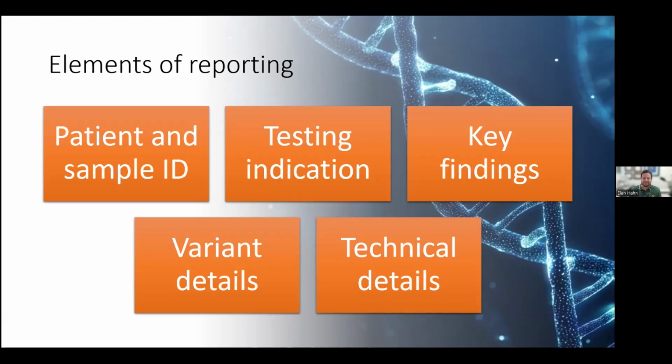So that you didn't have enough coverage of key genes in a negative test, that's a bigger issue than not enough coverage of a non-panel gene when you already have a variant that's significant.